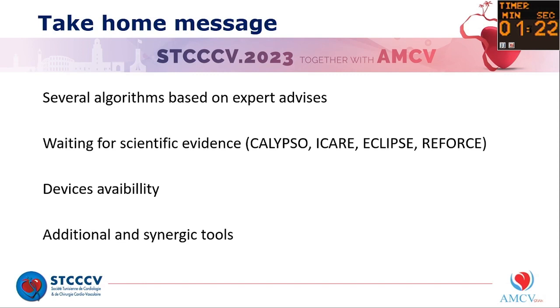Nevertheless, we are waiting for scientific evidence with Calypso, comparing an approach with and without endovascular imaging; ECLIPSE, which compares orbital to balloon, standard balloon, high pressure balloon; and Reforce, it's a French registry to prove the safety and the efficacy of the orbital atherectomy.